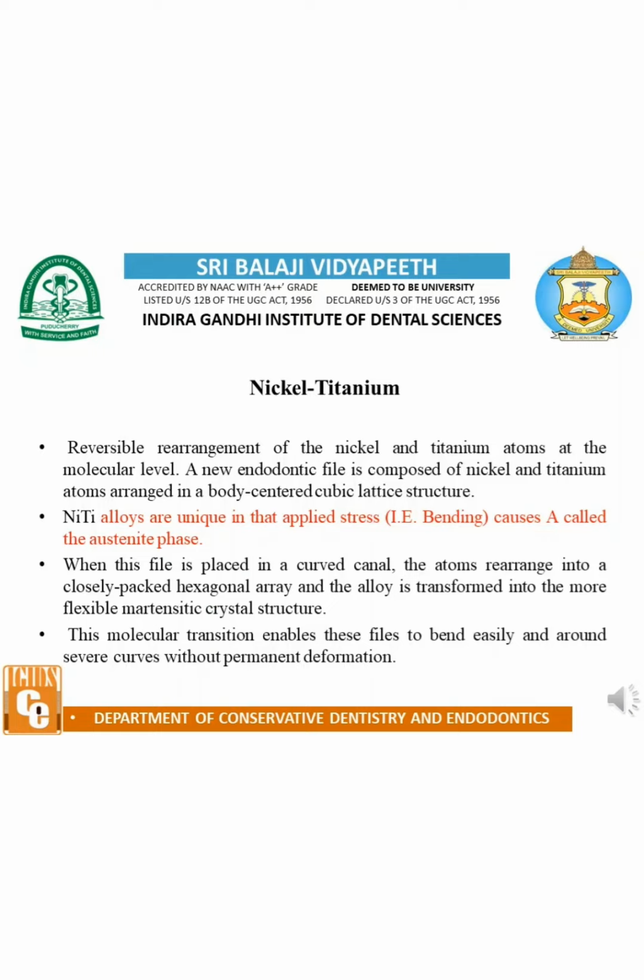When this file is placed in a curved canal, the atoms rearrange into a closely packed hexagonal array and the alloy is transformed into the more flexible martensite crystal structure. This molecular transition enables these files to bend easily around severe curves without permanent deformation.